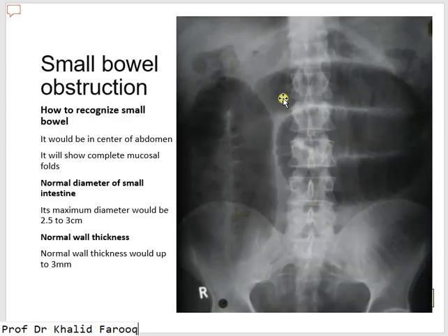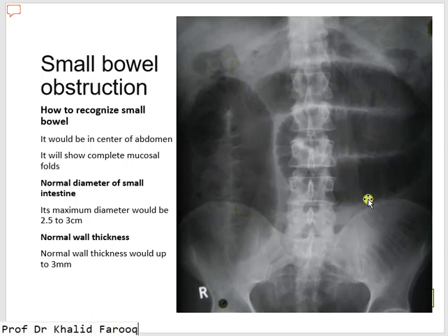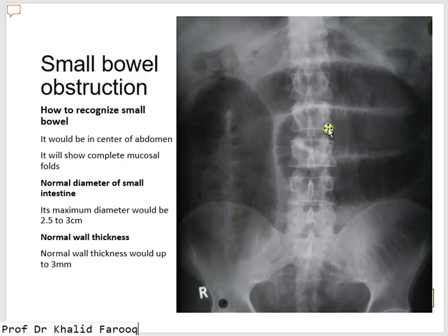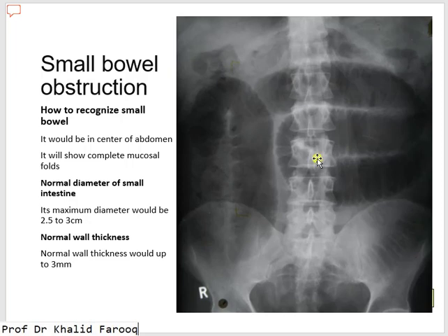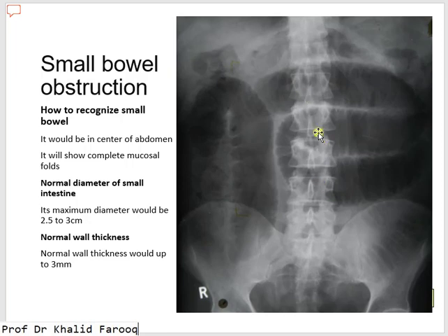On X-ray we can see a typical picture of small bowel obstruction: air in dilated small bowel with complete mucosal folds, confirming small intestine. The diameter should be between 2.5 to 3 centimeters; if more than this it is considered abnormal — dilated small gut. Wall thickness should be up to 3 millimeters. Small gut is located in the central portion of the abdomen and large bowel in the peripheral portion. Here gut loops occupy the central abdomen, with complete mucosal folds — confirming dilated small intestine.